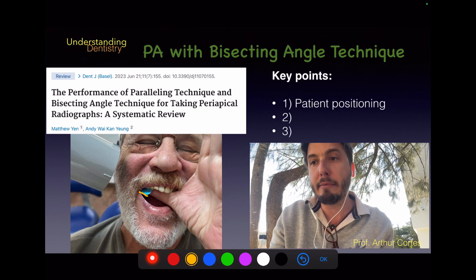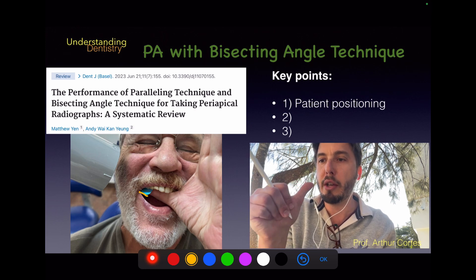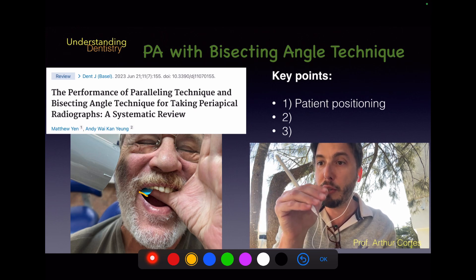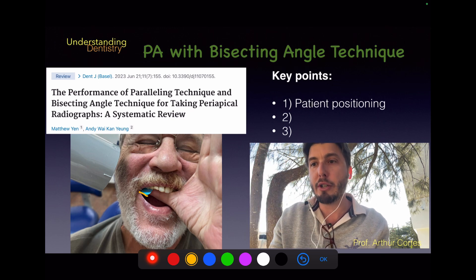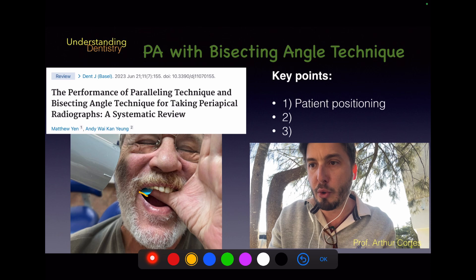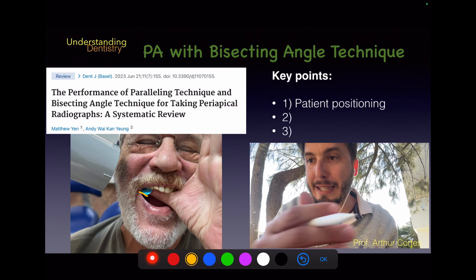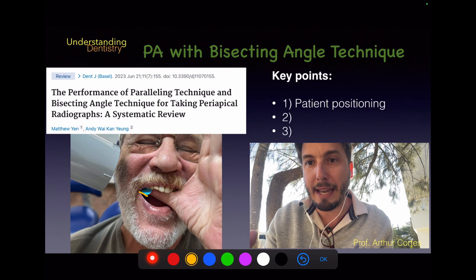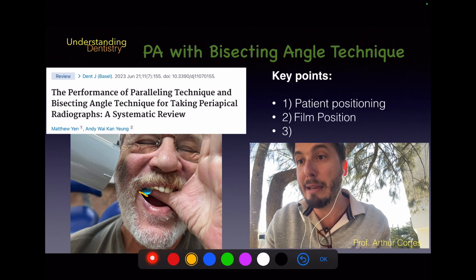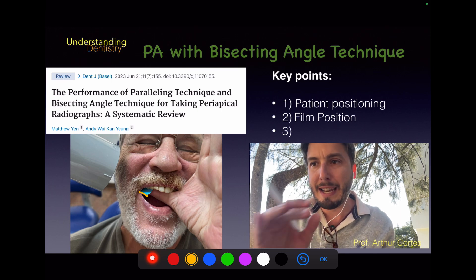The thumb is used to support the film for upper radiographs, whereas for lower radiographs we use the index finger. For an upper radiograph, orient the patient to use the thumb with all other fingers open, to prevent issues during the radiographic procedure. You can always retract the cheeks to make sure you are in the correct area.